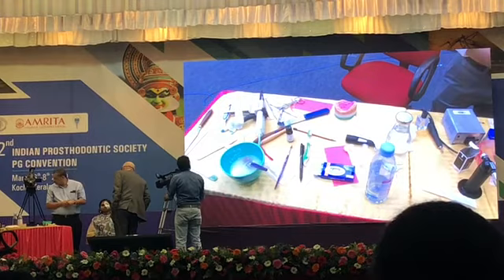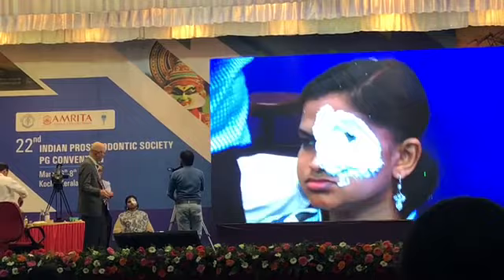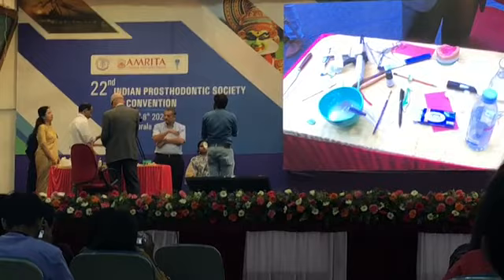You'll notice that we didn't make an impression of the opposite eye. You don't need to do that. It doesn't really help you at all, because you're not going to position the globe on the cast, you're going to position it on the patient. A lot of people do it on the cast, but it doesn't work. It's like using a computer if you want to. But I never use the cast. I do it always on the patient.